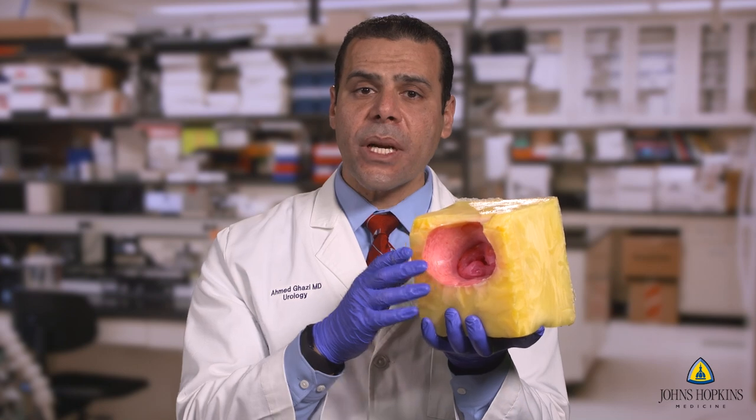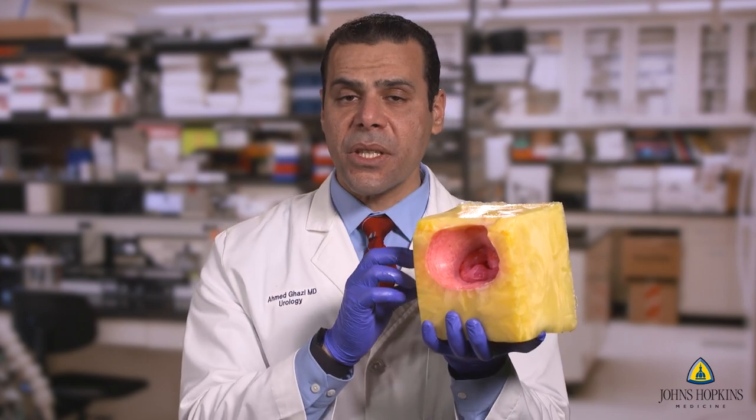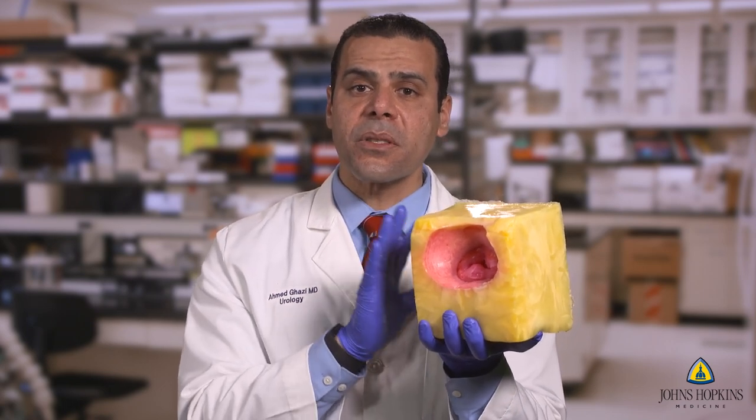We also created the entire anatomical components of the urethra, which are the verumontanum and the external sphincter, which are very critical components of this model.